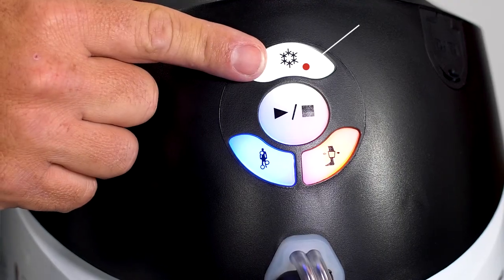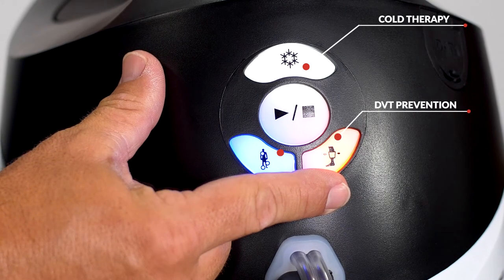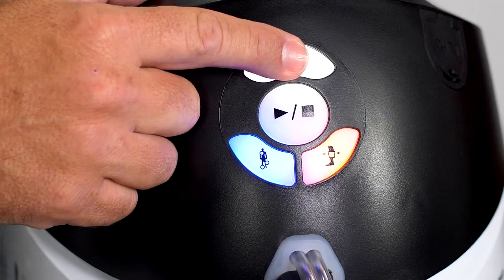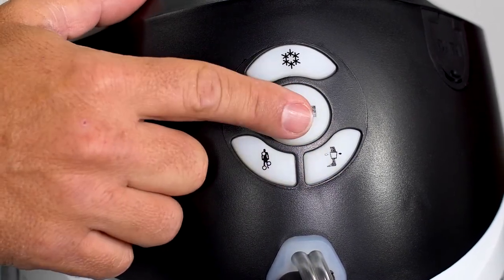The snowflake button is for cold therapy. The calf image is for your calf wraps for DVT prevention, and the image with the blue circles is for the compression at the cold site. Simply press each button to select which treatment you want, then press play to begin.